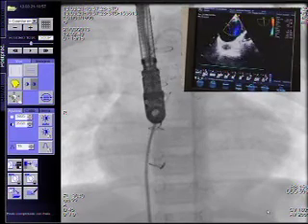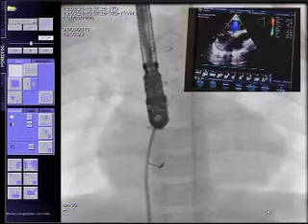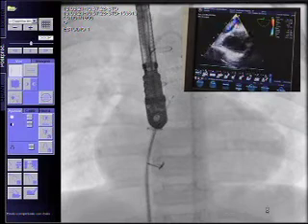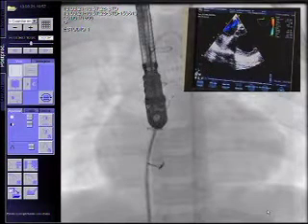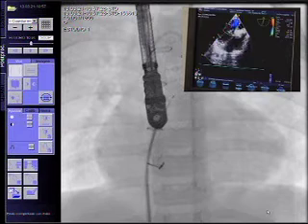I think you've got a very short distance before you get to the roof of the atrium. Yes, I think so, but this needle works with radio frequency, so the idea is not to put it far away, just to make the contact.